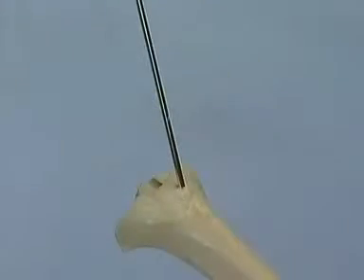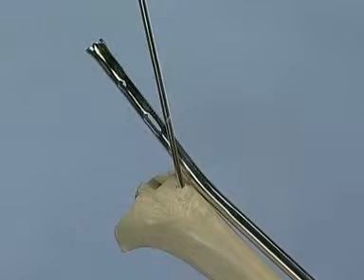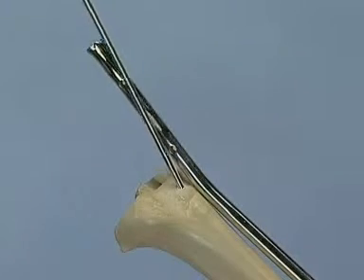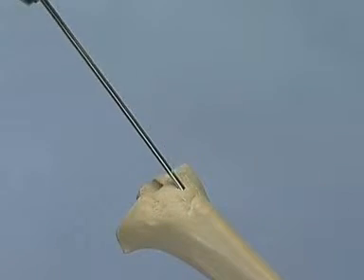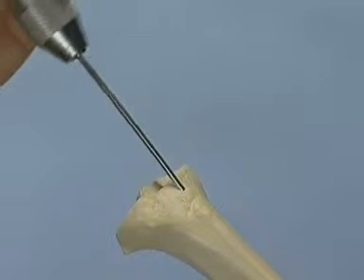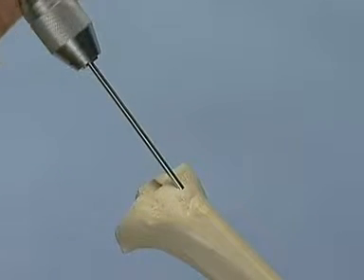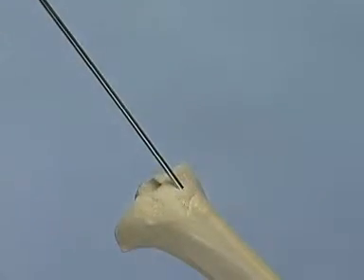To help orientation, an intramedullary nail can be placed on the anterior edge of the tibia. The centering pin has to be inserted so that it is parallel to the proximal nail curvature. The pin is advanced with the universal chuck with T-handle until the tip of the pin is in the medullary canal. Then the universal chuck with T-handle is removed.